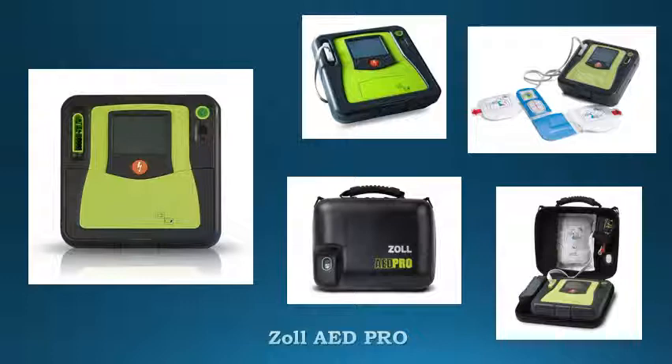Exceptional resistance to dust and water. Only AED in the industry to withstand a 1.5-meter drop test, making it suitable to withstand the rough treatment typically found in an emergency medical environment.